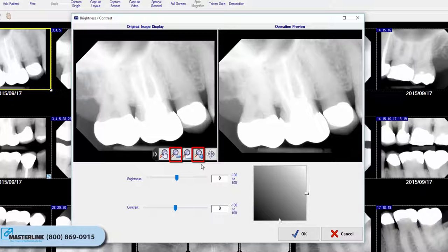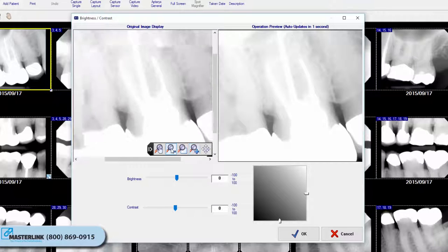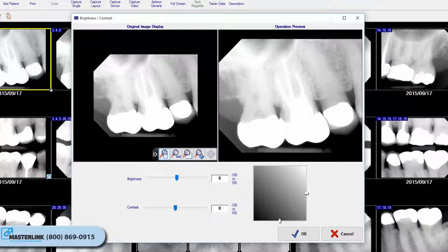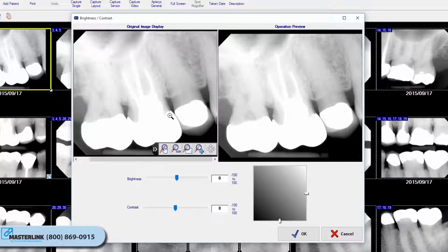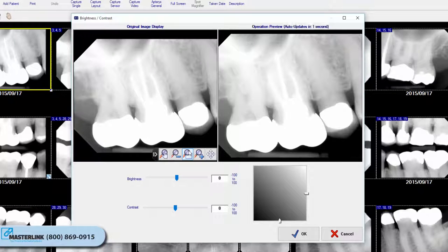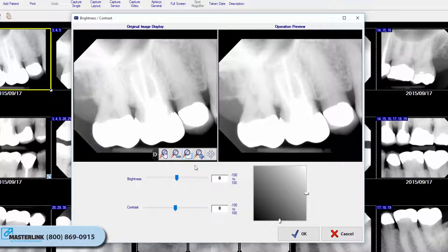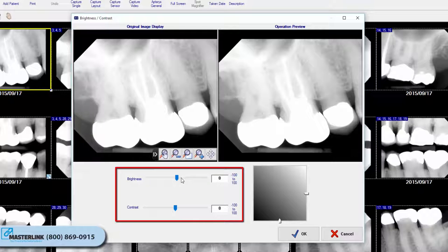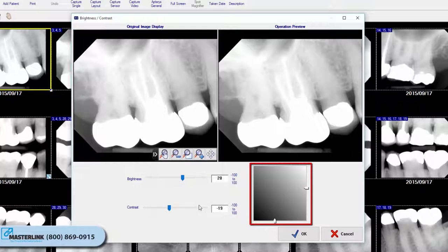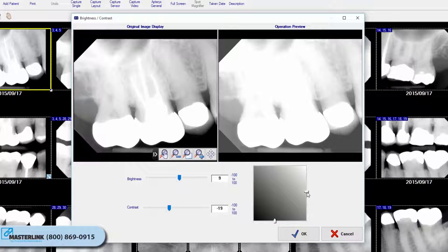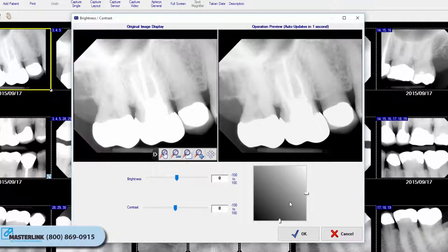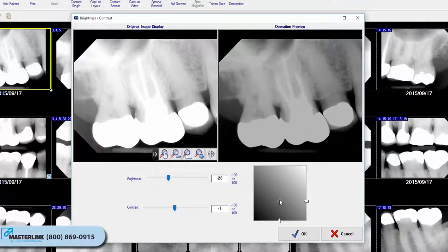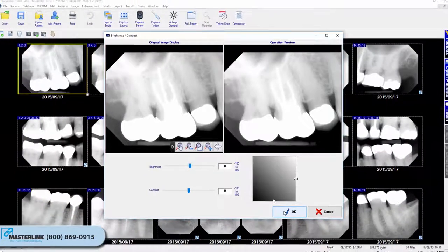Select the Magnify or Reduce button to adjust the image in the preview. To magnify an image, click on the image in the preview with the left mouse button. To reduce the magnification, click with the right mouse button. Click the Auto Resize button to automatically resize the image to fit the viewing area. Use the Brightness and Contrast sliders to enhance the image as desired. The enhancements are adjusted in real-time in the resulting image preview area. Click OK to apply the settings, then click Save to store the changes.